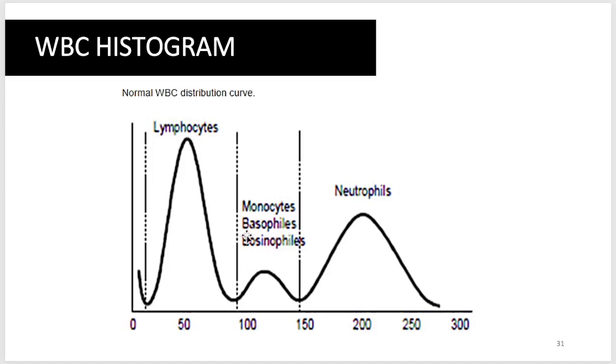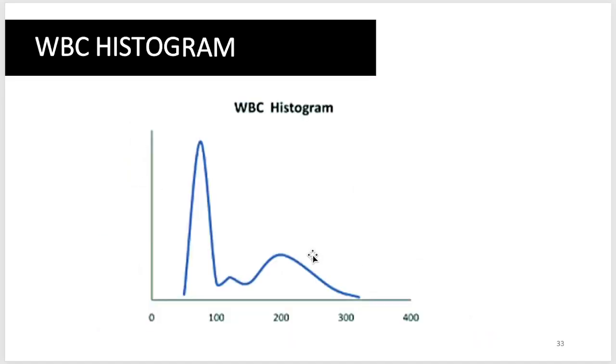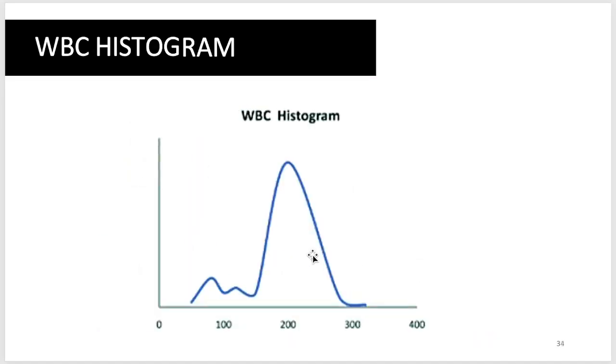But ang problem natin is yung mid cells, no? Kung dito yung tataas, we're not able to identify kung ano kaya sa tatlo ang nag-increase. Pwede bang combination? Yes, pwede. Pwede yung tatlo talaga nag-increase, or pwede lang na isang parameter. So that is your WBC histogram.